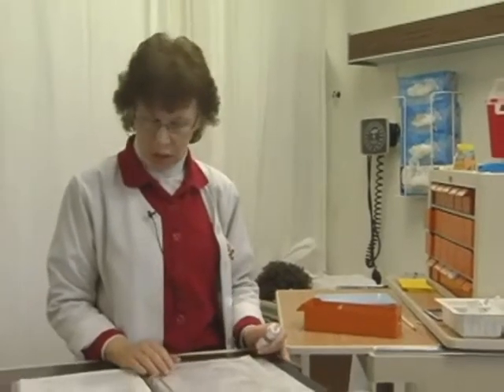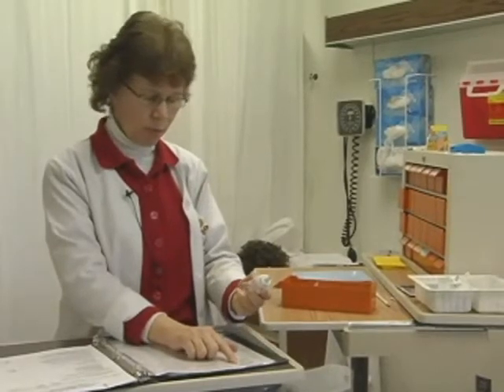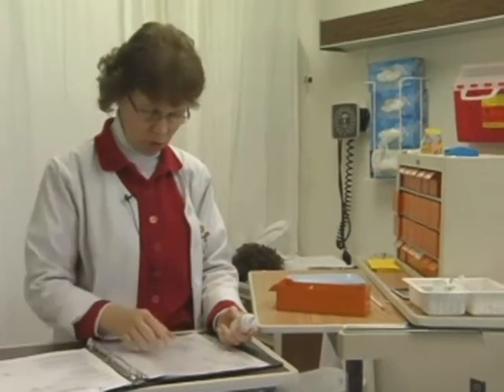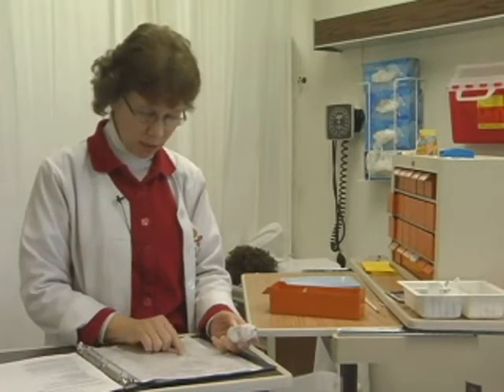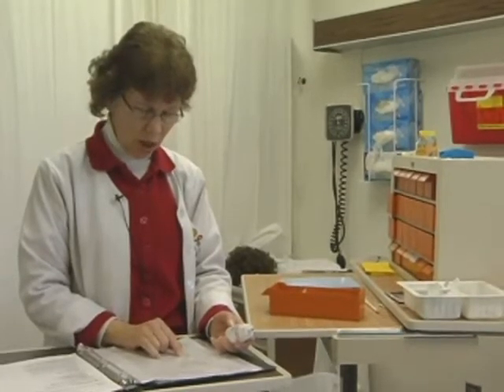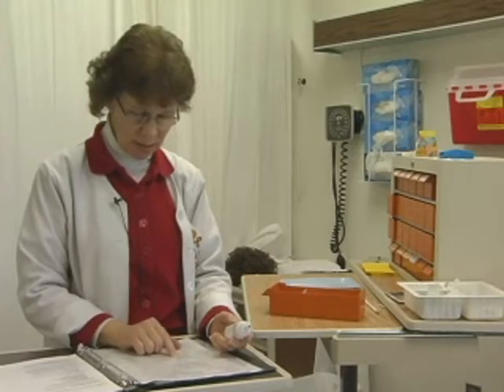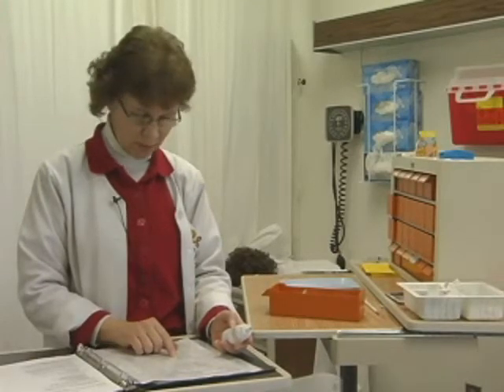So first thing I'll do is my first check on my medication. I have Harmon Wagner, ID 47672. The medication is Zofran, and I have Zofran. The dose is 4 milligrams. I have 2 milligrams per ml, so I'll have to do a calculation. The route is IV push, so I will get a syringe with an IV adapter on it. Frequency is every 4 hours as needed for nauseousness, and he had it last night at midnight.